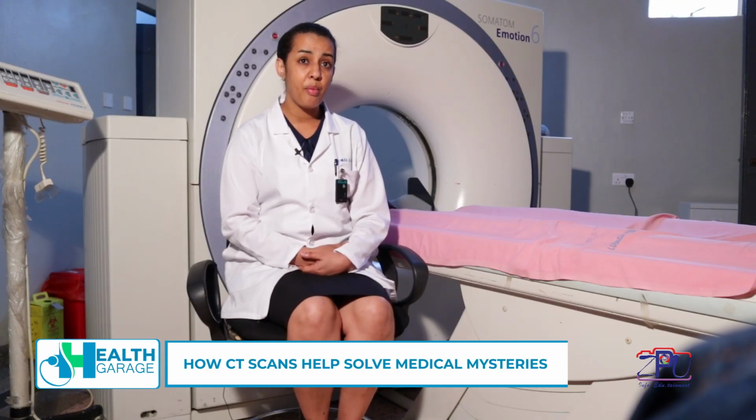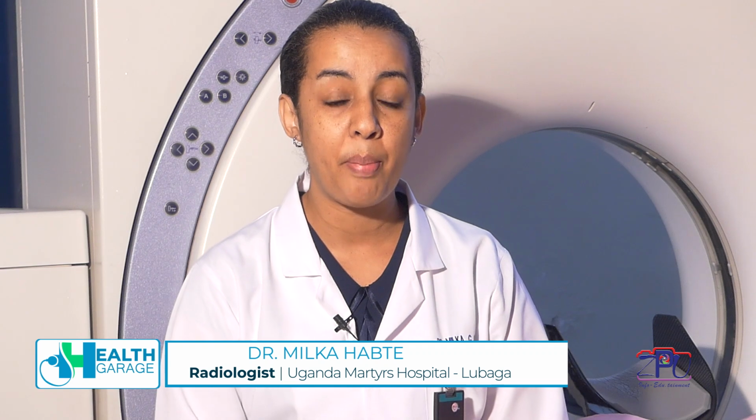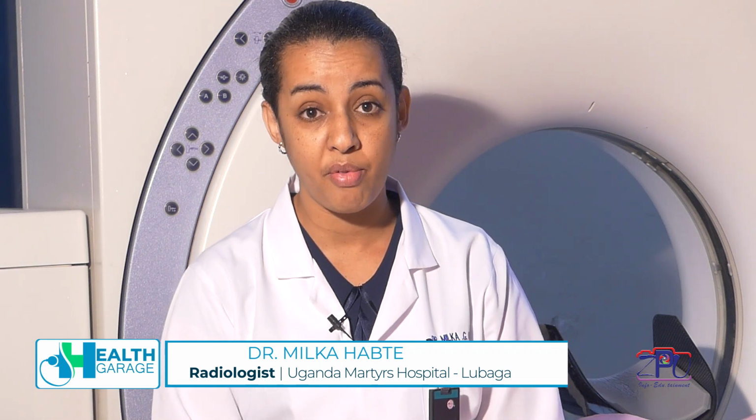A patient should come with a legal request form from a certified clinician. That's when we go ahead and do the CT scan. We also have to make sure the patient doesn't have a high risk to the investigation. We use contrast media.